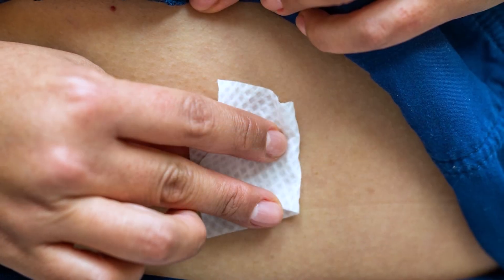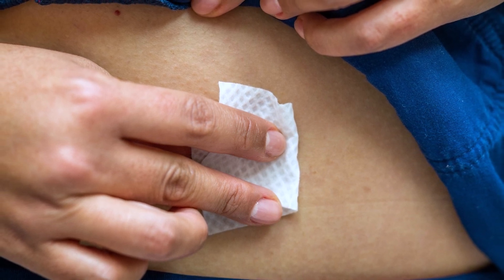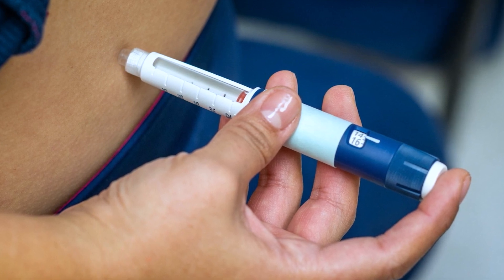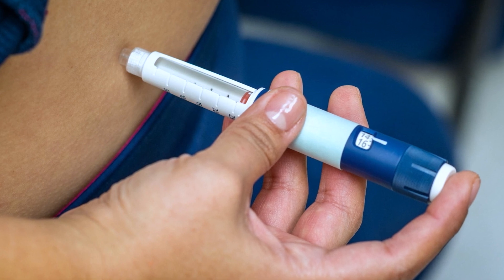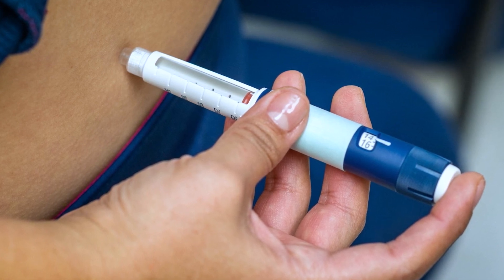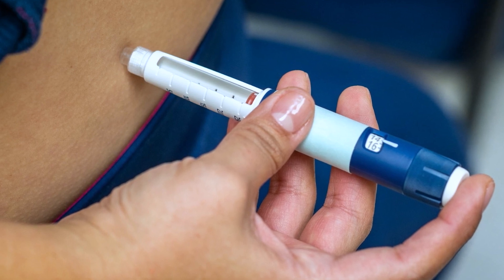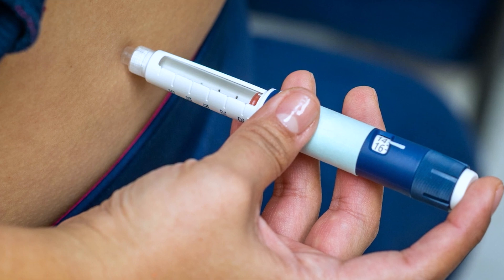Step 6: Clean the skin with an alcohol pad and allow the alcohol to dry completely. Step 7: Pick up the insulin pen and quickly push the needle straight into the skin at a 90-degree angle. Use your thumb or index finger to press down on the dose knob until it goes back to zero. Hold the needle in place for 10 seconds to prevent leaking, then pull the needle out.